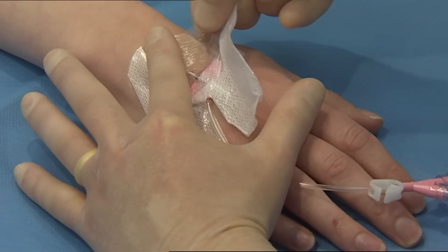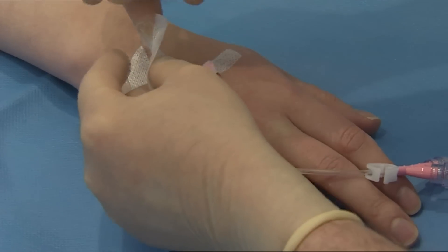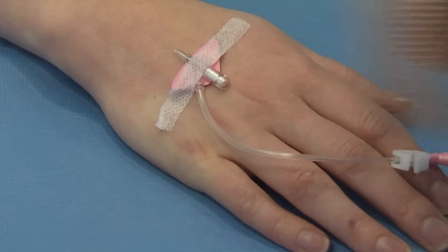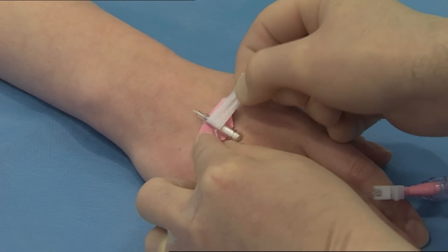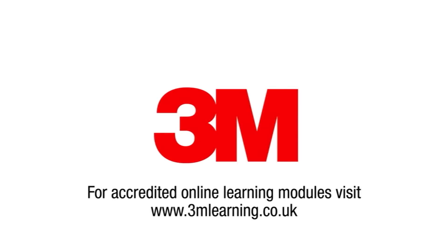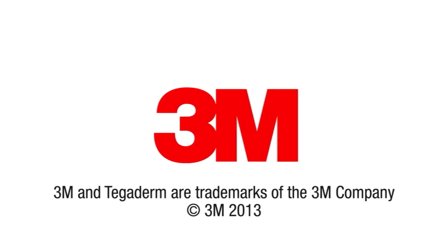Alternately stretch and release the film section parallel to the skin to break the adhesive bond. Carefully remove the remaining securing strip whilst holding the catheter in place.